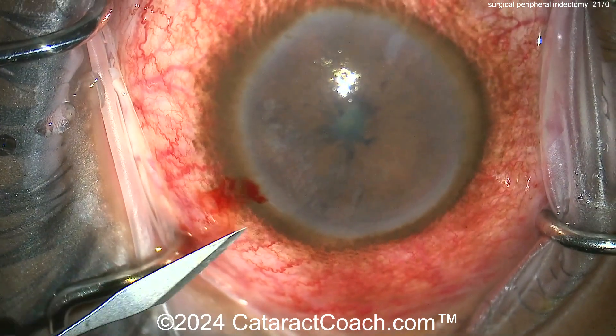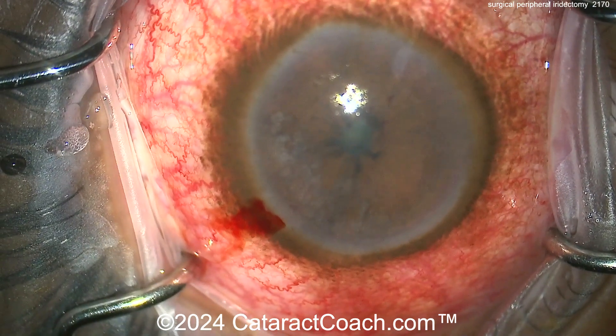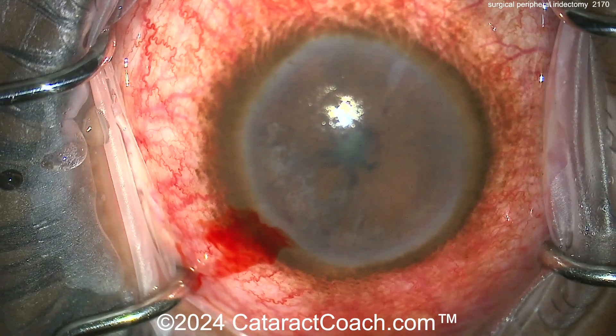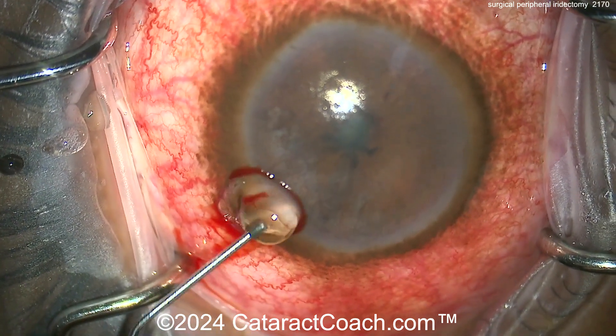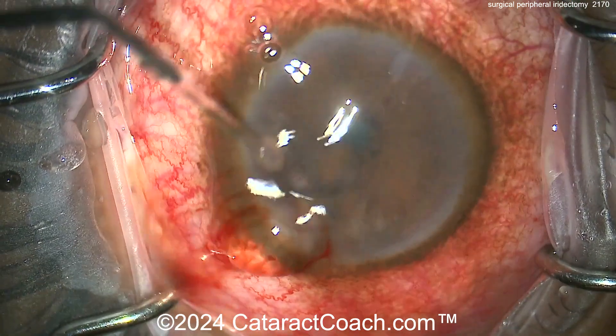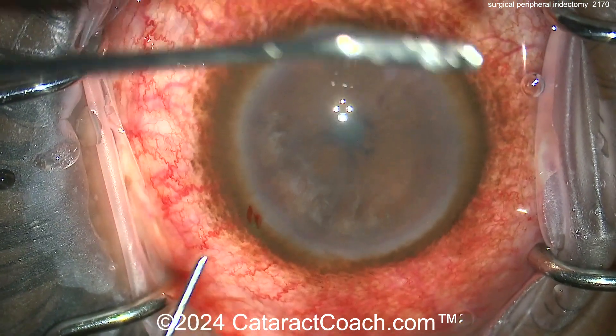The incision is extra wide, probably about one and a half to two millimeters in width, and has a good long tunnel length so it seals up. This can be done with a retrobulbar block or peribulbar block to keep the patient comfortable. Here's just a small dollop of viscoelastic — not too much — just to give yourself a little bit of room.